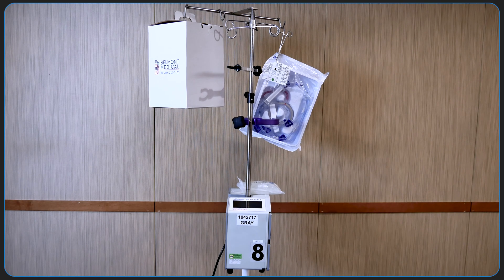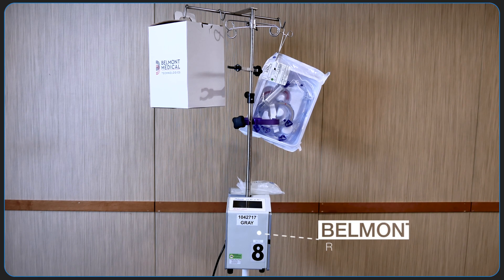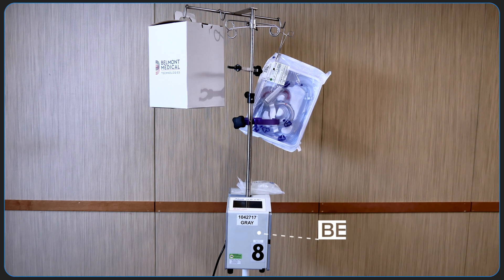In this video, we're going to demonstrate how to set up a Belmont Rapid Infuser. This is the Belmont Fluid Management System or FMS2000 Rapid Infuser.